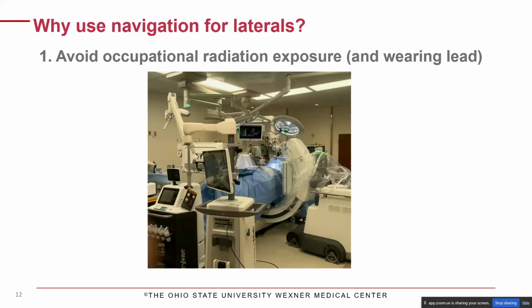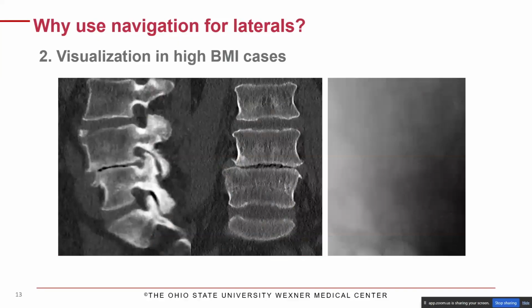So why do that? Well, number one, it does help you avoid occupational radiation exposure. You also don't need to wear lead. So here, this is a picture of one of our cases where you have this imaging system performing the registration with everybody out of the room, with the exception of the patient.